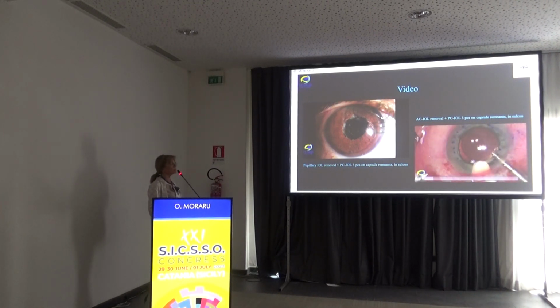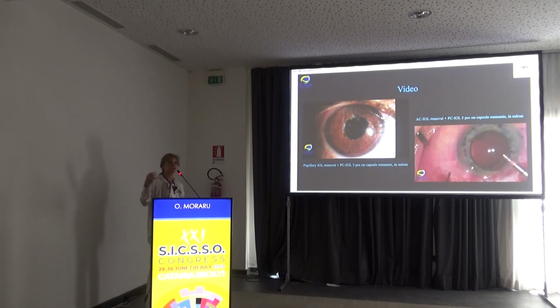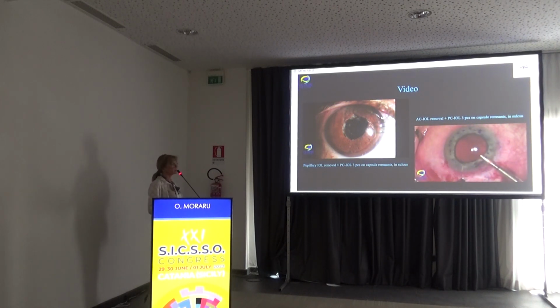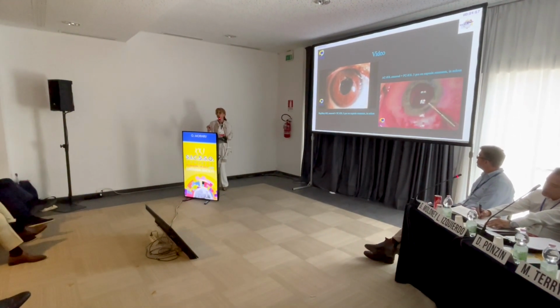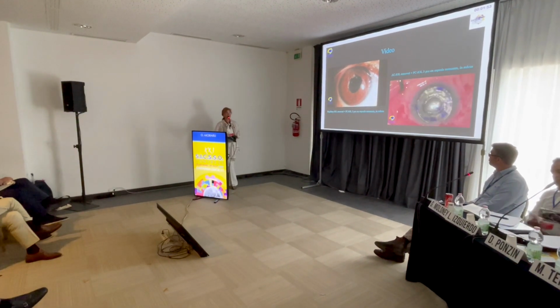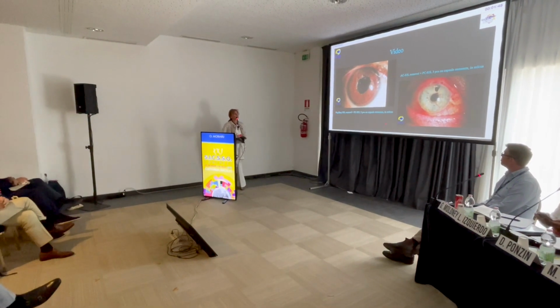The same thing here, only that here we have an anterior chamber IOL, which is much easier to explant if it's not buried in the iris or whatever more complicated eyes, like traumatized eyes, can be. And again, we have sufficient peripheral capsular remnants, but be careful, you need to have sufficient capsular remnants, otherwise you can have a dislocated IOL and you can find it on the retina or something. This eye went quite well. This is the post-op image.